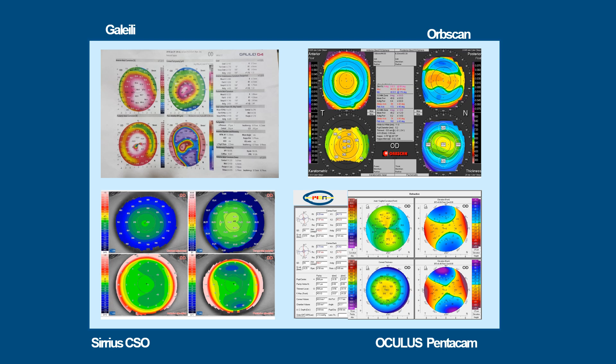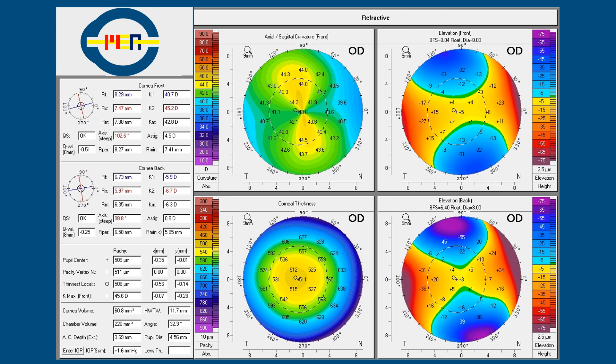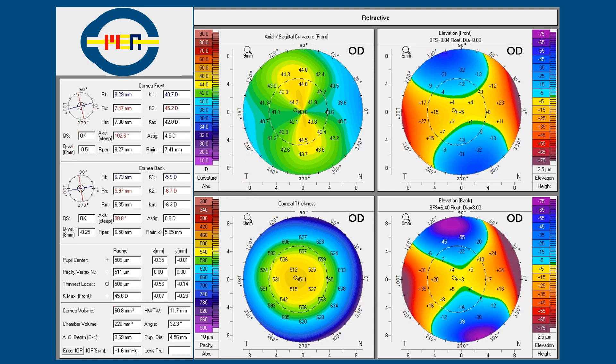These are the printouts from four different machines. I will pick just the values from one of the printouts and magnify it. It has got some parameters on the left-hand side and then the parameters on the maps. First, we will do the left-hand side ones.